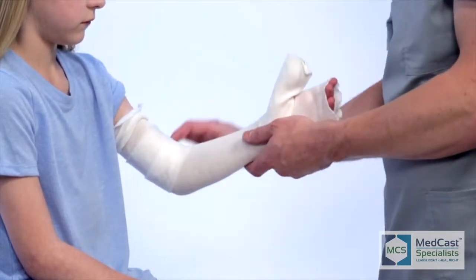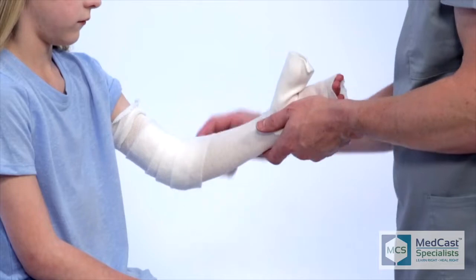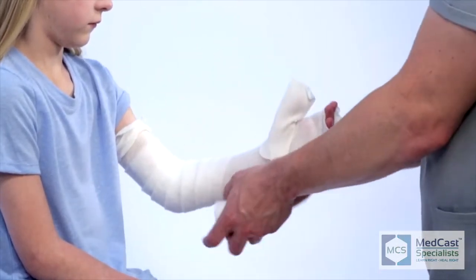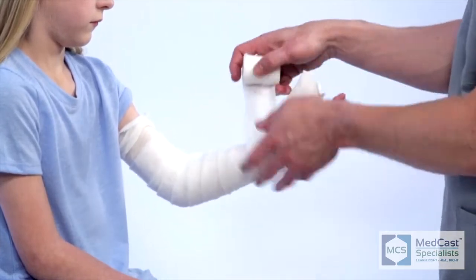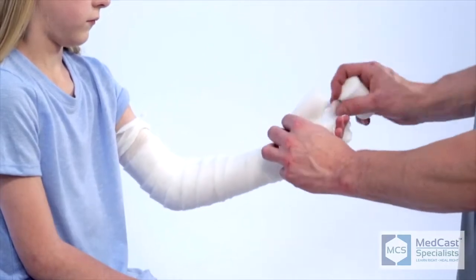For application of the cotton, go up just above the elbow enough so that when you pull the stockinette back it'll make a nice soft edge around the top of the sugar tong splint. Good technique going through the thumb and web space.